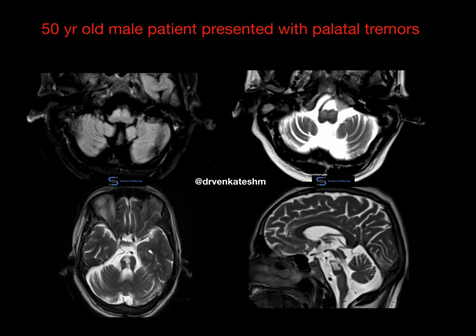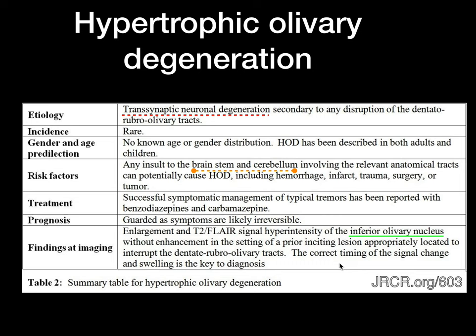At the level of medulla, you can see the hyperintense and swollen inferior olivary nucleus. This is the FLAIR and this is the T2 axial image. At the cranial sections, at the level of the brainstem, you can see the chronic infarct in the pons and caudal section of midbrain. So this is a classic case of hypertrophic olivary degeneration.